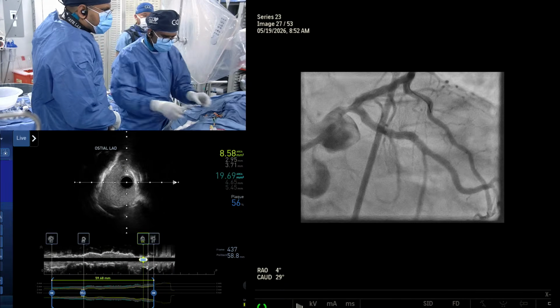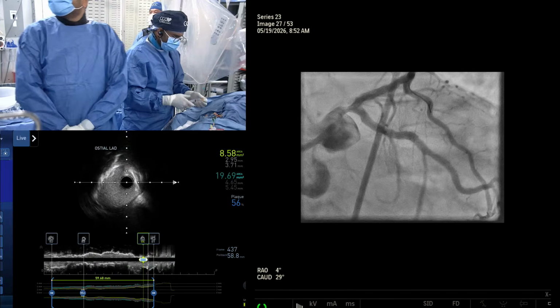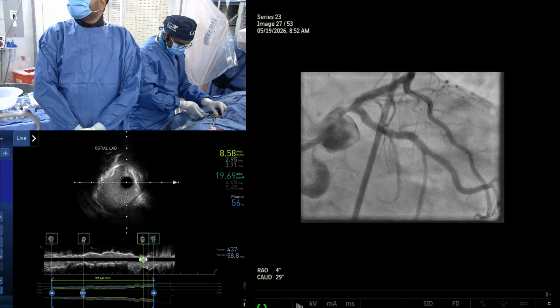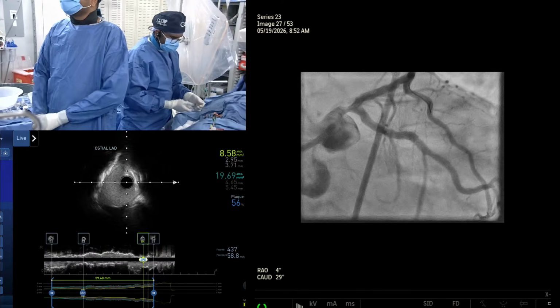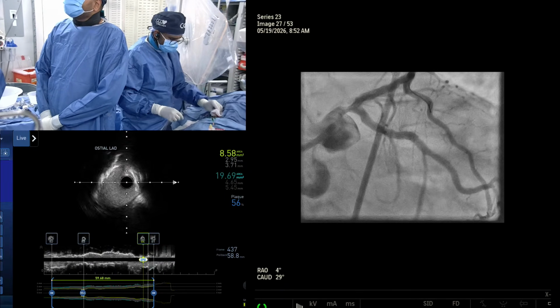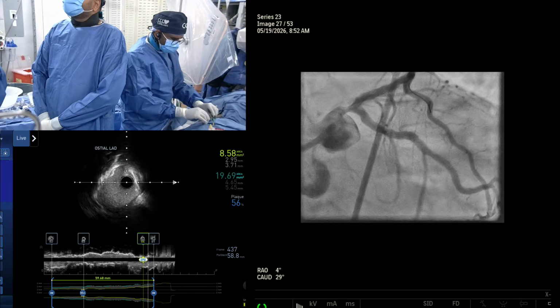And this is what all the randomized trials of intravascular imaging have shown. No matter how good you are, how much the protocol, in about 42 to 50% of cases you do not get all the components of your optimal stent, like minimum cross-sectional area and so on and so forth. And here in this case, the question always comes: would you have delivered 8 pulses instead of 4 in that area? Would the outcome be different than what we have now?